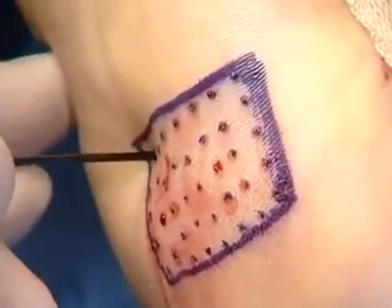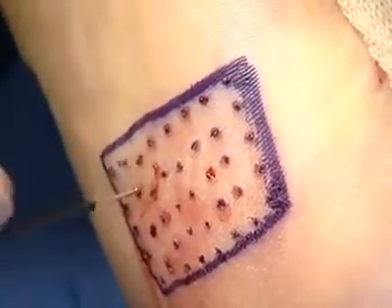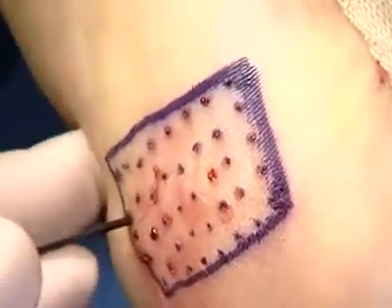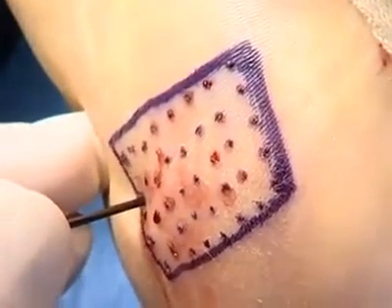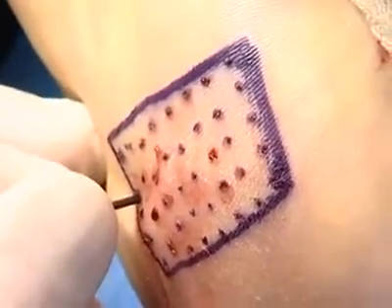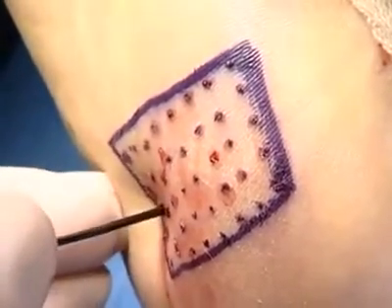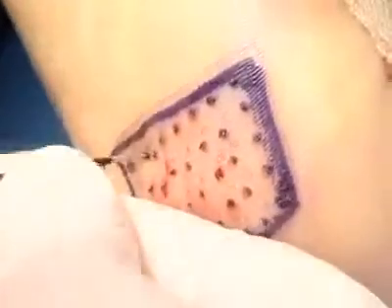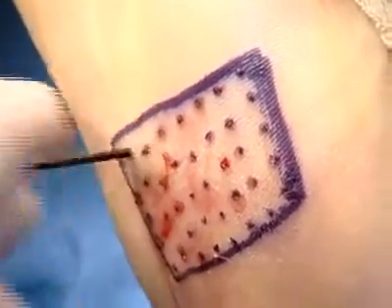Once all holes have been created, the Topaz wand is then introduced and the plantar fascia resistance is felt. At this time, the pedal is stepped on and the Topaz wand is brought through the plantar fascia, releasing the Topaz energy, and then an additional application of Topaz is utilized deep in the plantar fascia.